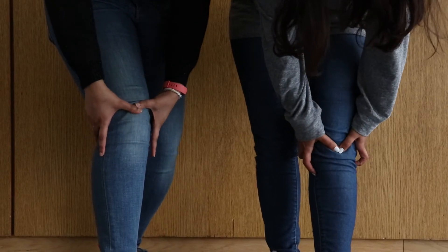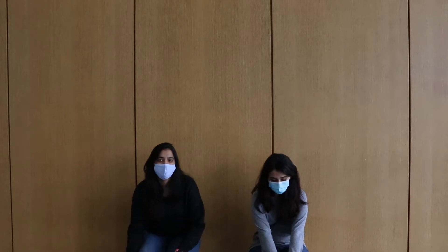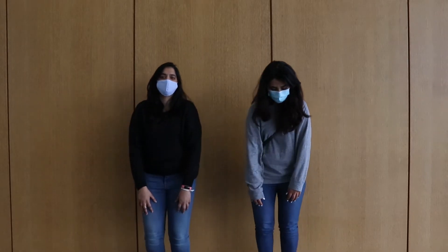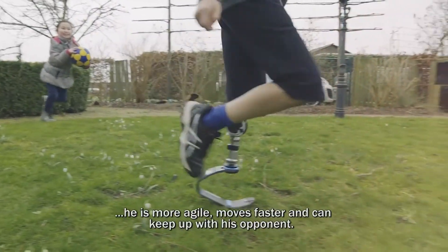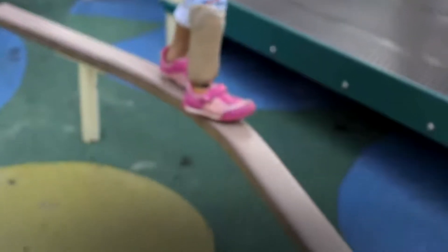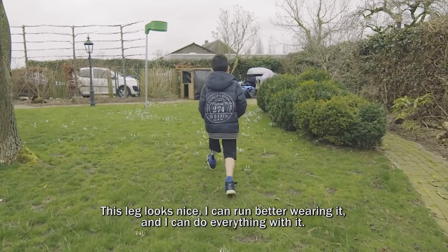For most everyone growing up, we all experienced some pain within our legs and joints, which eventually led us to gaining height at no second thought and no cost. But for families of children and teen amputees, growing becomes costly as they are constantly outgrowing their prostheses in length and size, therefore needing new ones often.